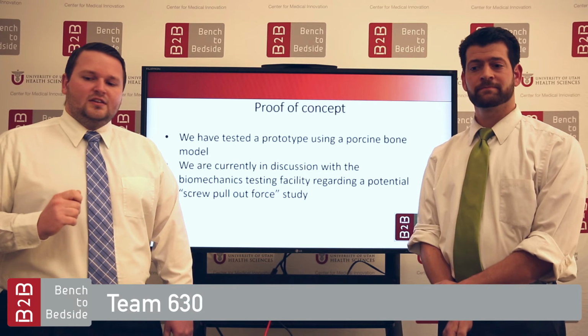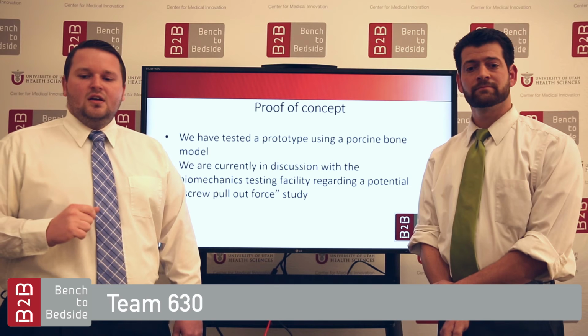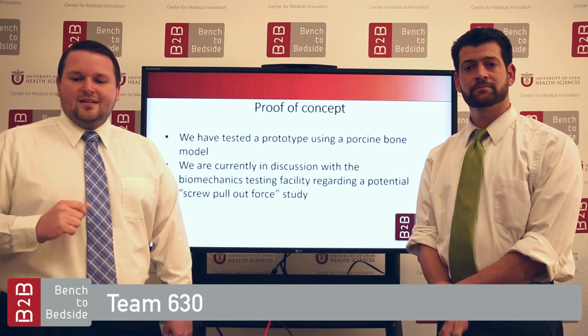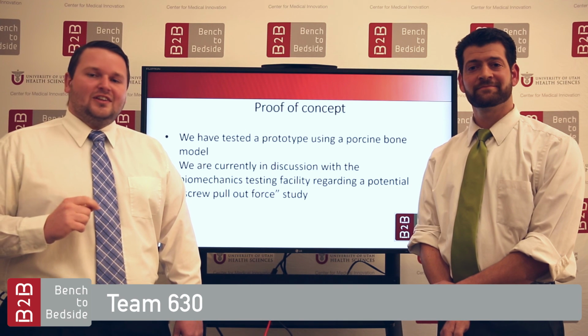So far, we have practiced this on a porcine bone model, and we are in communication with the University of Utah and their biomechanics testing facility to provide a screw pull-out force study.